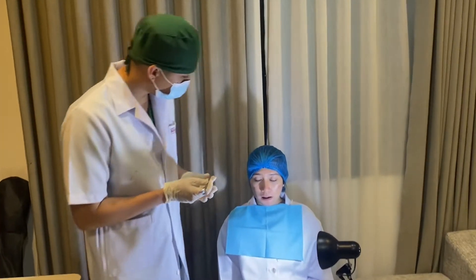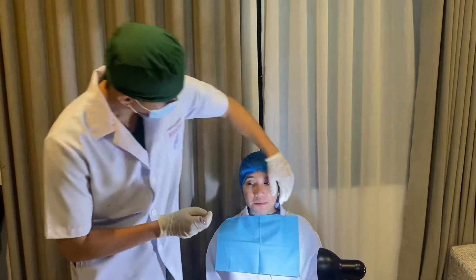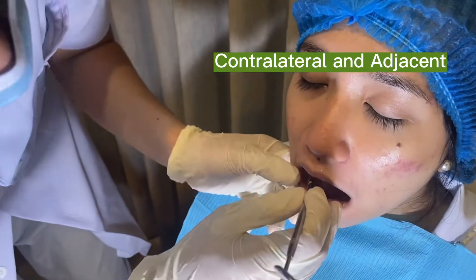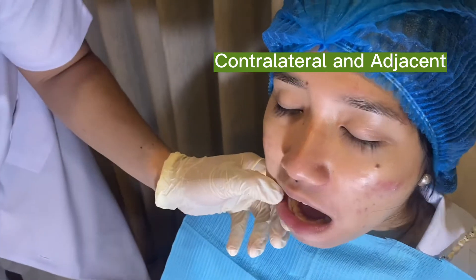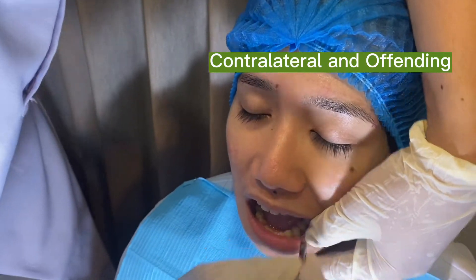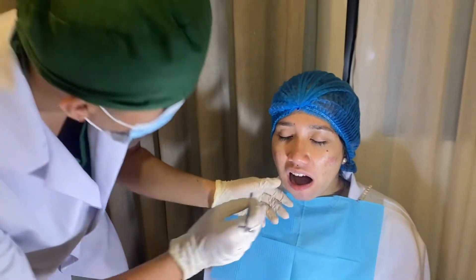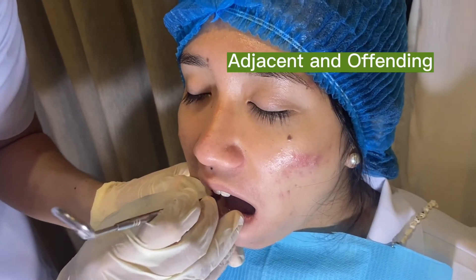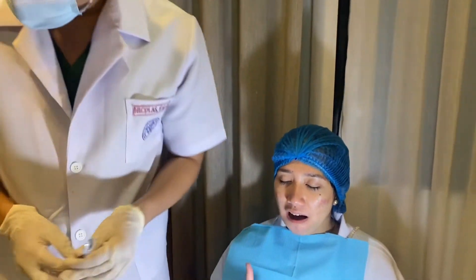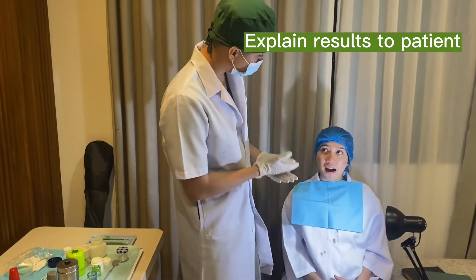Ma'am, just tell me if you feel any difference. I will be pertaining to numbers — this is 1 and this is 2 — and I will ask you if you know the difference. This is 1, this is 2. Is there any difference? Any pain? So your surrounding structures around the teeth look normal, and it feels normal — those are normal responses.